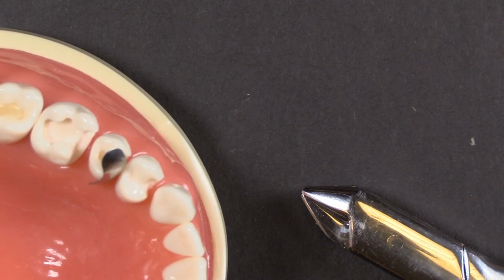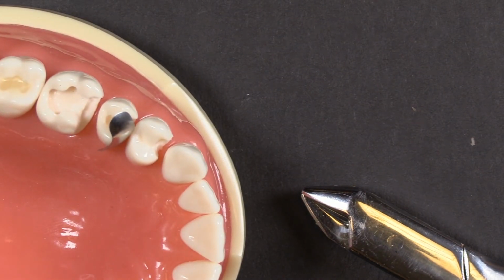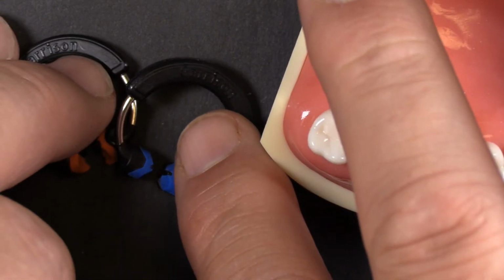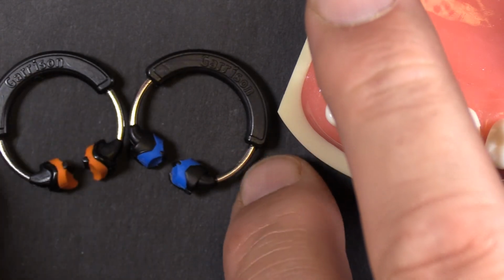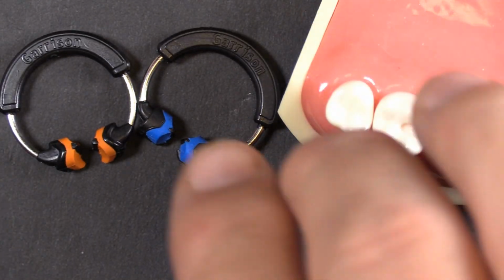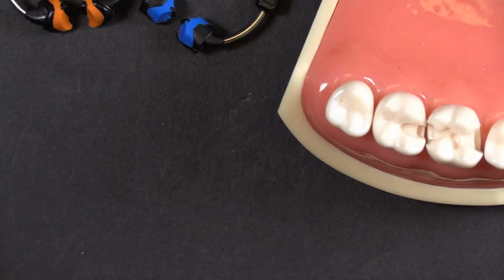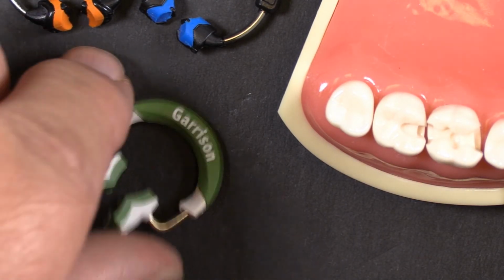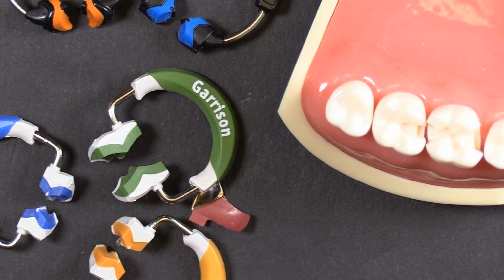Some basic ring placement techniques will help with keeping the ring in place and making it easier to place, with the new rubber-tipped rings. These were the ones we did in 2012, 2014, I think. We did the blue ones, and then this is this year's crop, the 2017 Fusion system.